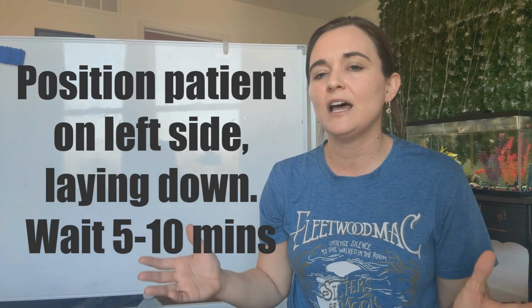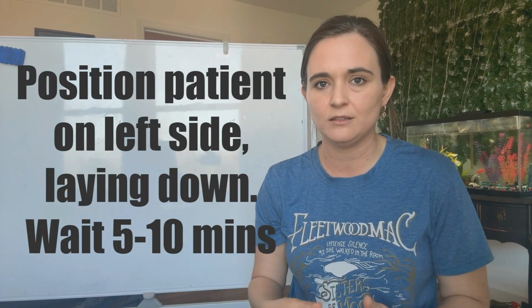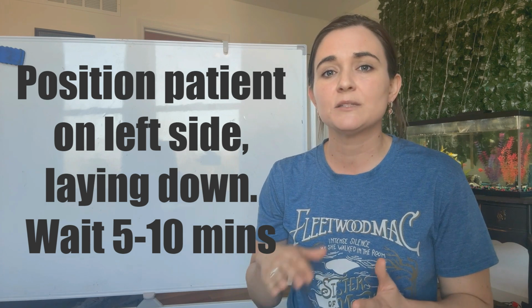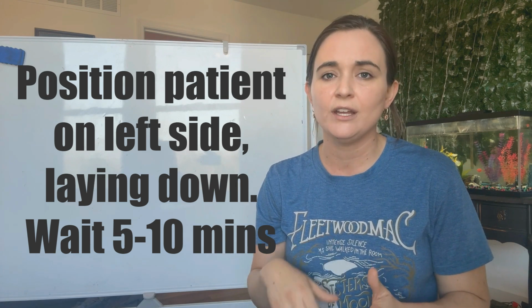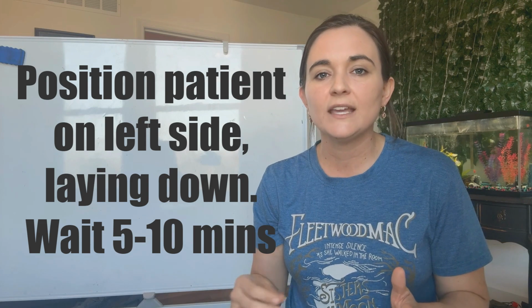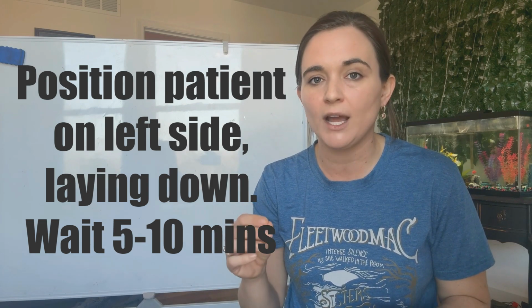Now, what if she can't stand? That's where the left lateral decubitus comes in. We roll Mrs. Garcia onto her left side, place a sponge behind her back to straighten her, and give it 5 to 10 minutes before we take the shot. That gives free air enough time to rise.